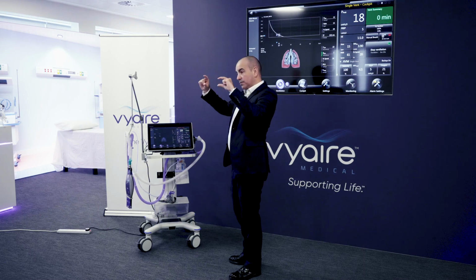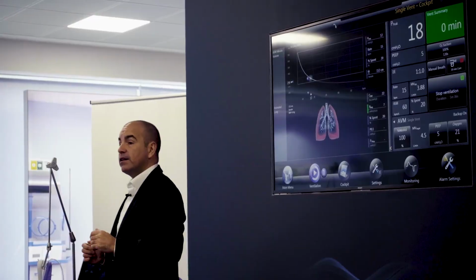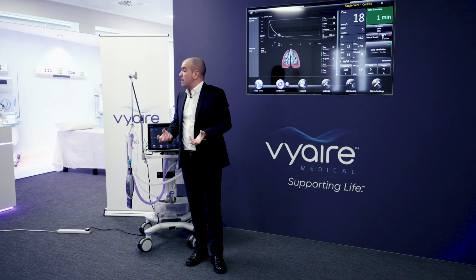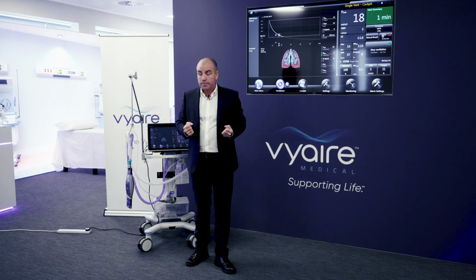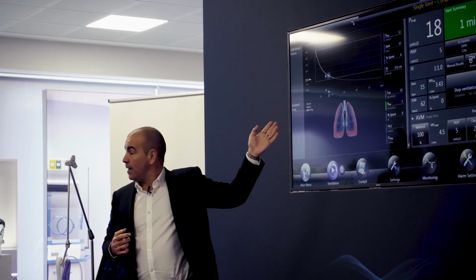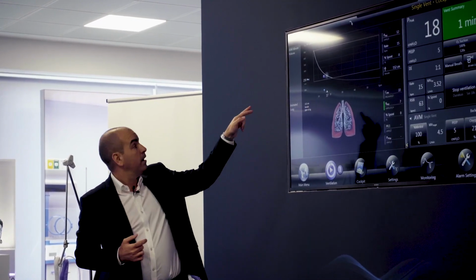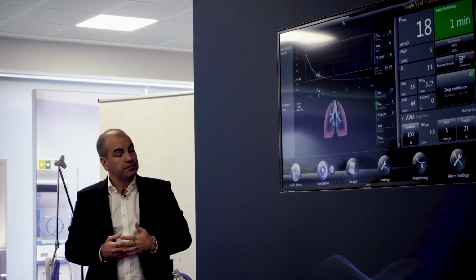So again, you have that elongated rectangle. The lung fields here are showing that there's redness, that it's detecting that the lungs are not as elastic as they were, and it's taking that into account. So we see now, instead of having a rate of 12, the rate's up to 17 or 18, and the volume is dropping. So again, it's aiming to protect the patient.